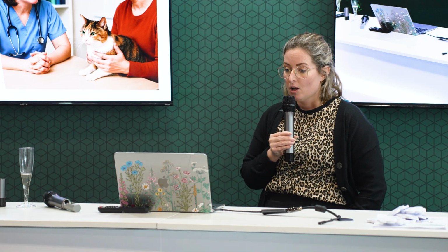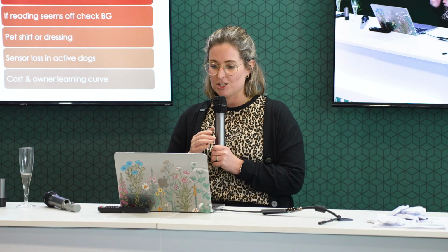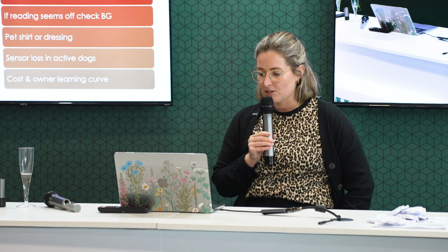And again, perhaps providing some printed troubleshooting information for the app as well. I think one thing we do just need to be mindful of is that some owners can get a little bit fixated sometimes, when we get a new app and you're constantly looking at it: what's the number, and is this... So again, I think this is where communication is key, and counselling them early on will hopefully avoid that.